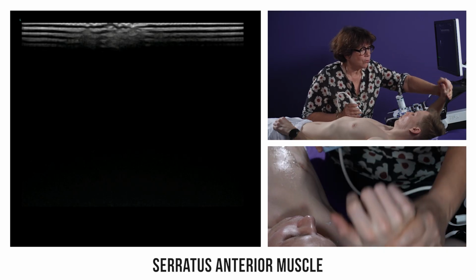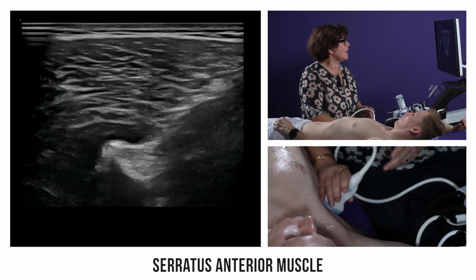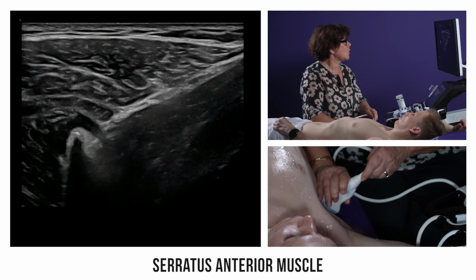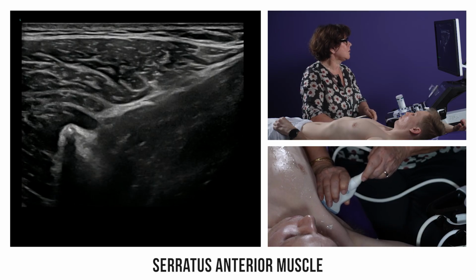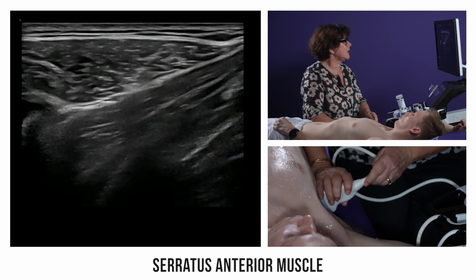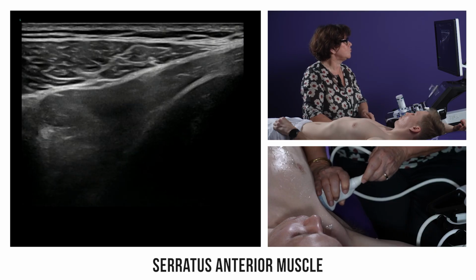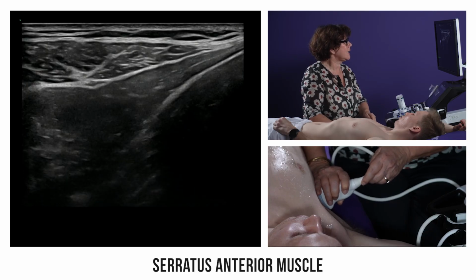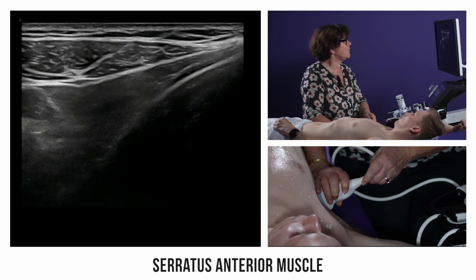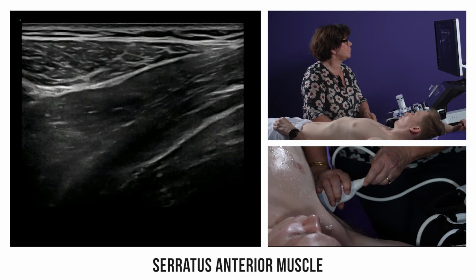Raising the patient's arm allows for a better view of the serratus anterior muscle. Our landmark is the spine tip of the scapula, visible here. Laterally, we can see the serratus anterior along the ribs. On its surface, we can trace the long thoracic nerve running along the muscle.